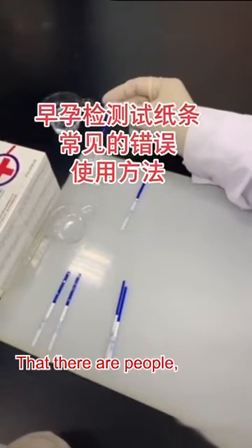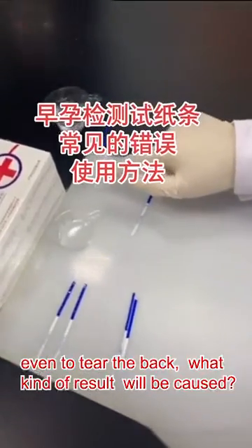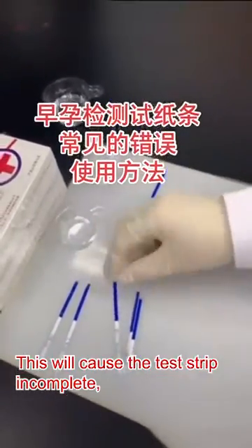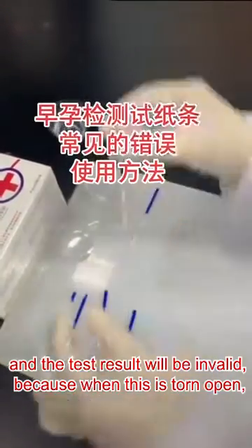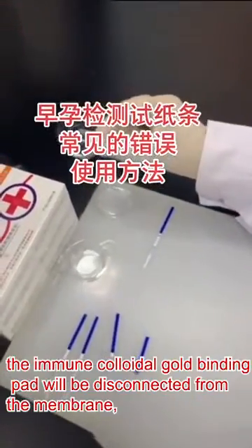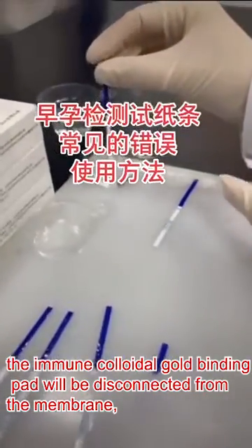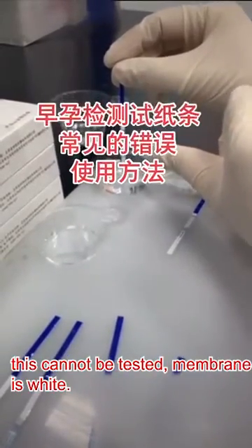There are people who tear the test strip in front of the max line, the tape, even tearing the back. What kind of result will be caused? This will make the test strip incomplete, and the test result will be invalid, because when it is torn open, the immune colloidal gold binding pad will be disconnected from the membrane, which will cause the liquid to fail to climb up. This cannot be tested.